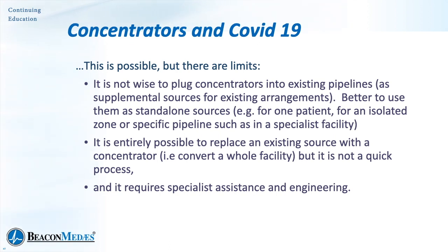And the reason it's not a good idea is because of that 90 to 96 problem. We'll mix those two oxygens and we won't necessarily know what level of oxygen we are providing to our patients. Now, again, it's the same oxygen, it has the same therapeutic benefit, so could it be done? Absolutely. Would it work? Yes, it would, as long as everybody knew what was going on and was using oximetry correctly.